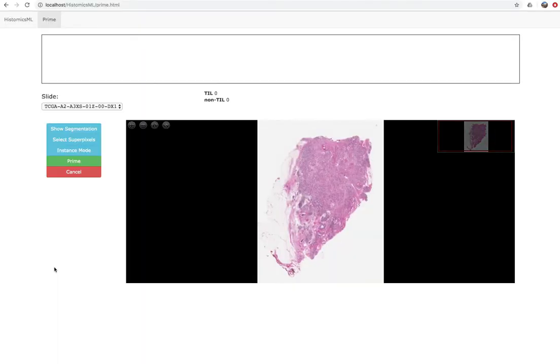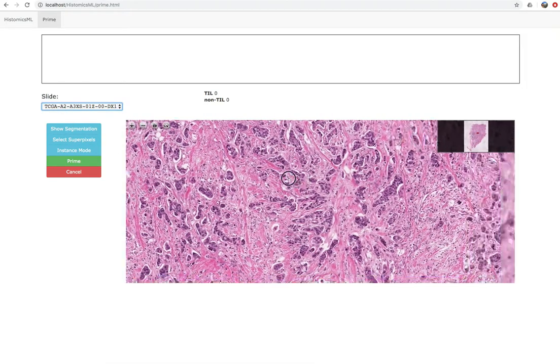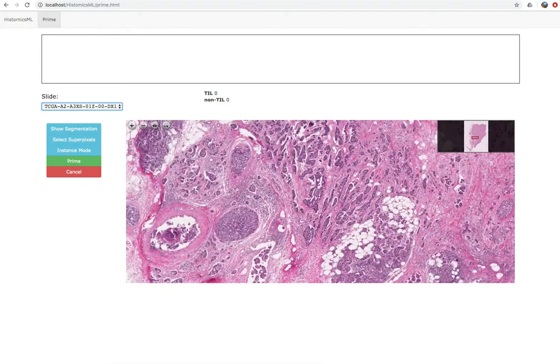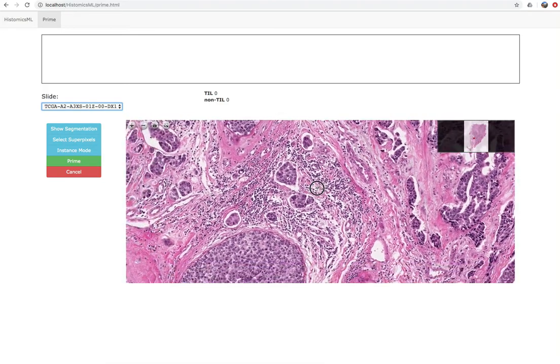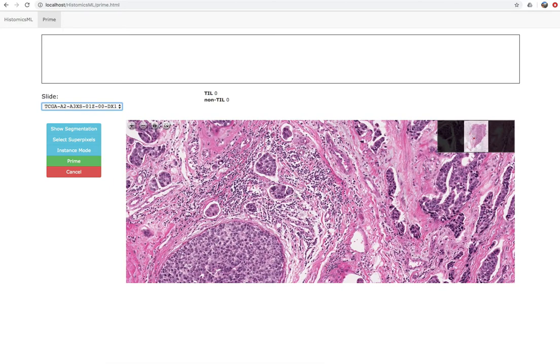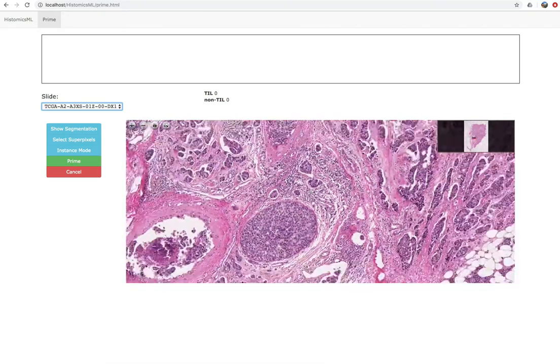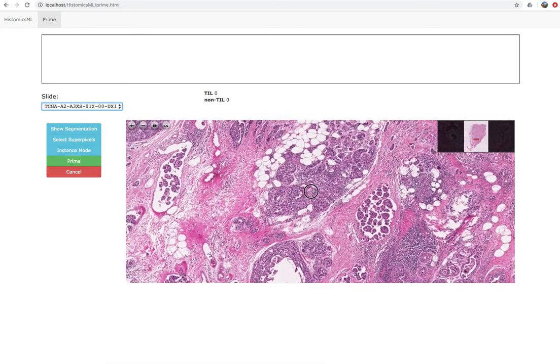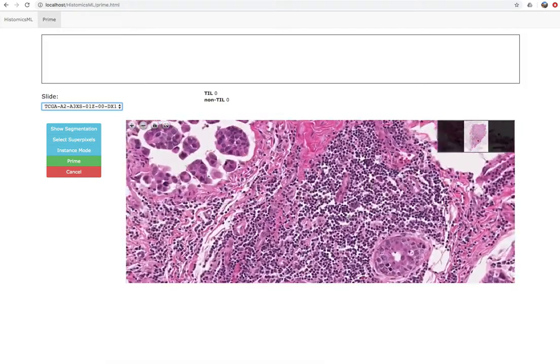The first task in active learning is to provide training examples to initialize the classifier — we call this process priming. On this page we have a whole slide image viewer where you can select slides and explore their contents. Use the mouse wheel to adjust the magnification, and click the mouse button and drag to pan the slide. Here we're looking at a breast cancer slide containing a large number of lymphocytes that appear as small dark mononuclear cells. These will be our tumor infiltrating lymphocytes that we're trying to develop a classifier for.